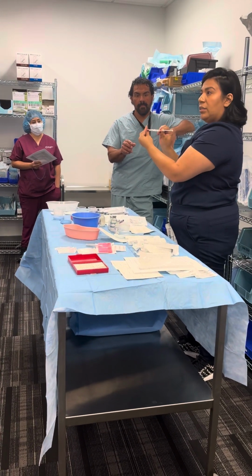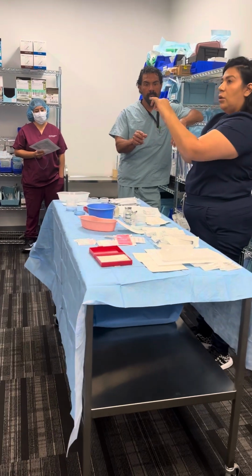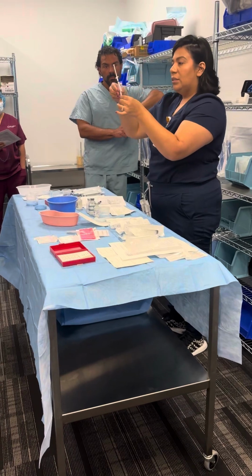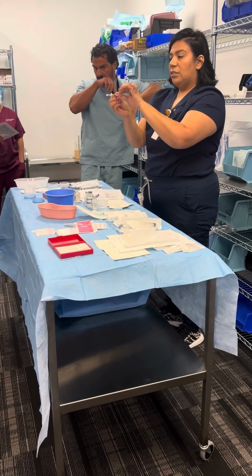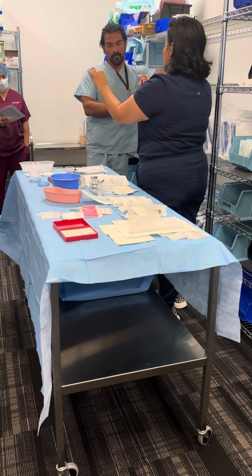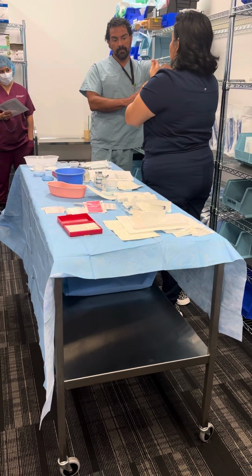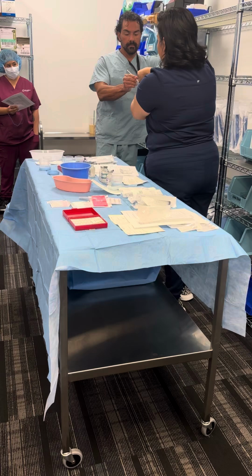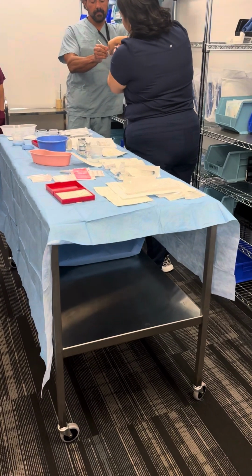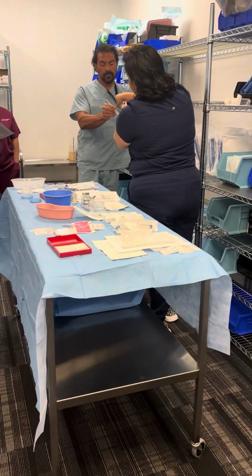I put the label the same way. I hold this pencil tip at the bottom. I take this off with my left hand, and I'm gonna do this motion. Cap comes off. My wrist is going to do this. And I'm gonna pass it to him like this, keeping the needle away from my hand. And once I can feel that he has it, I'm going to let go.